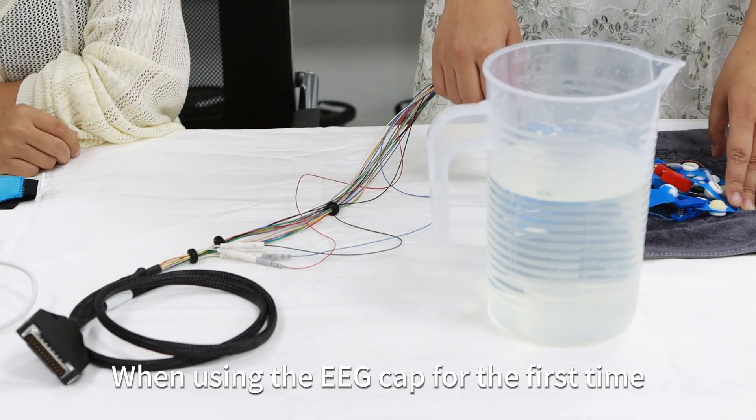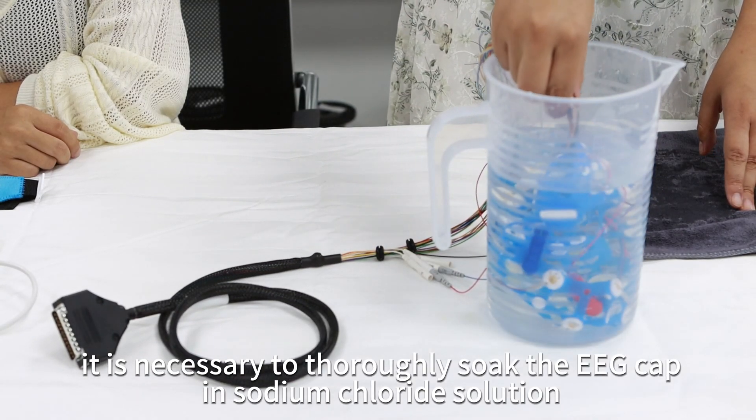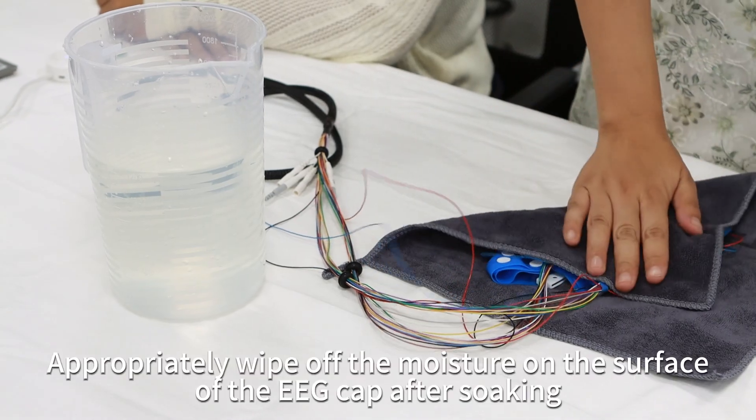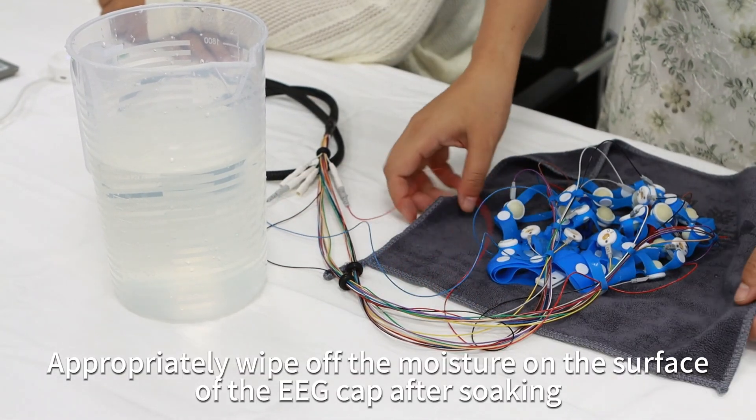When using the EEG cap for the first time, it is necessary to thoroughly soak the EEG cap in sodium chloride solution. Be careful not to get the connectors and external wiring wet. Carefully wipe off the moisture on the surface of the EEG cap after soaking.